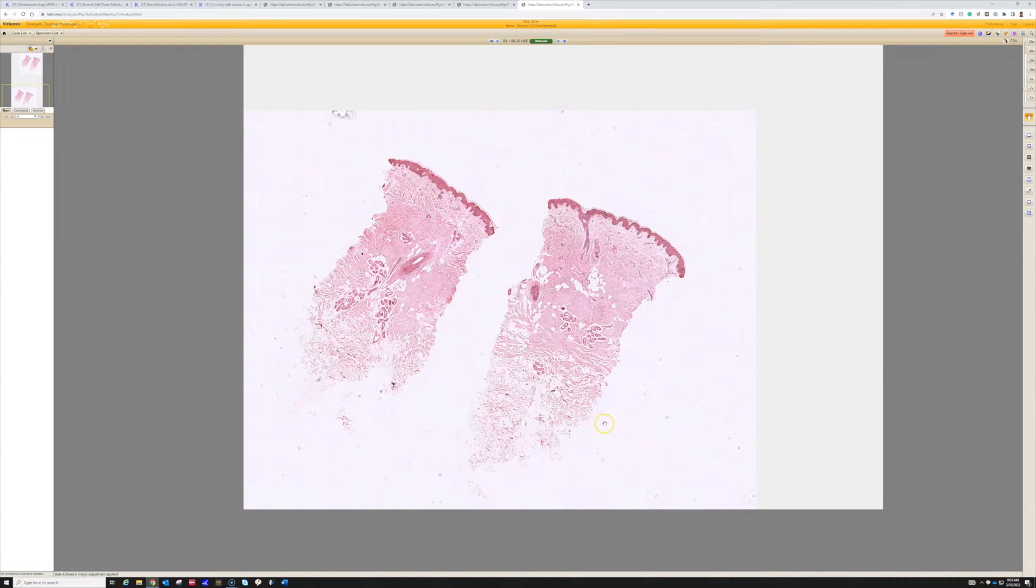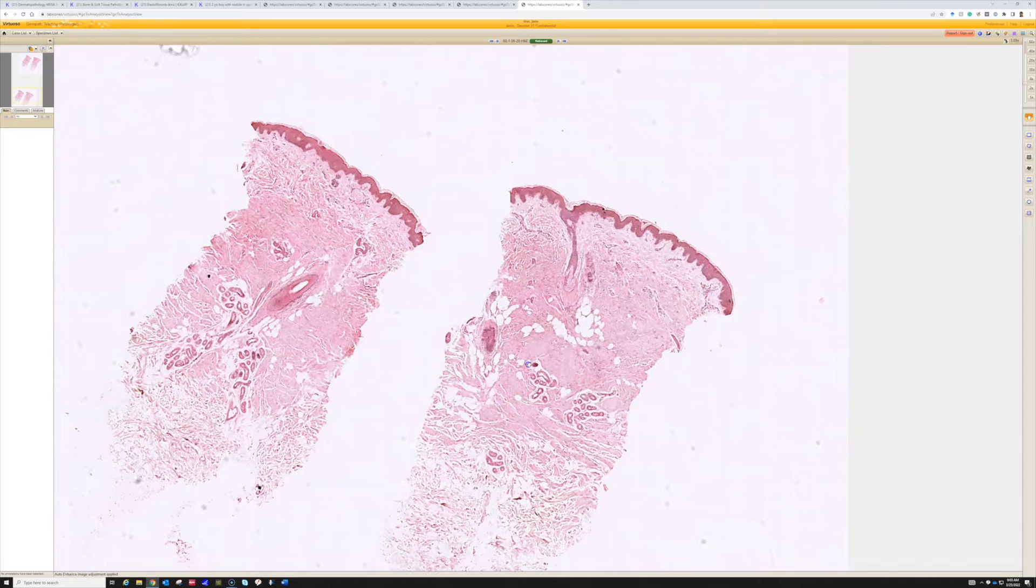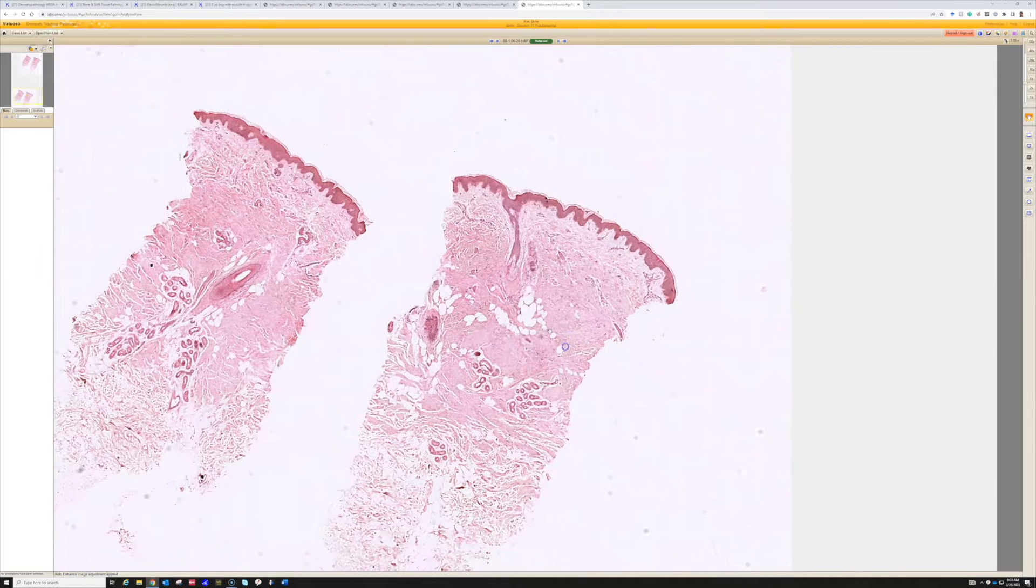So this is a nice biopsy. We have a punch biopsy here, and you can see in the middle of the specimen there's this pink area kind of forming a band. You can imagine this was like a wider plate-like lesion that we just punched one punch down in the middle of.